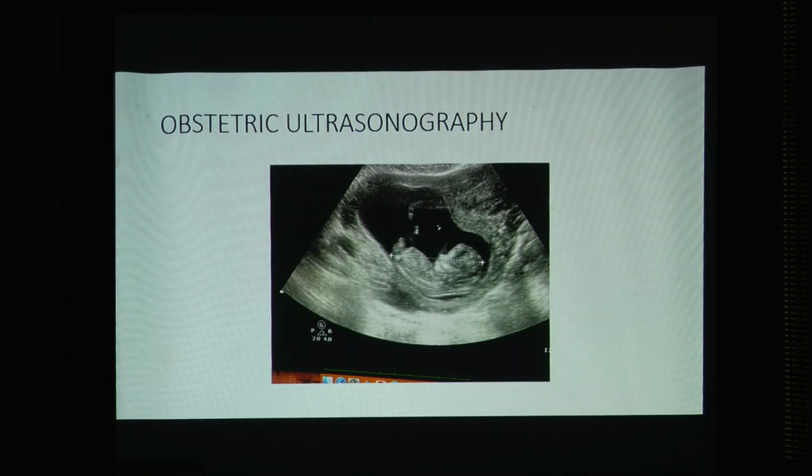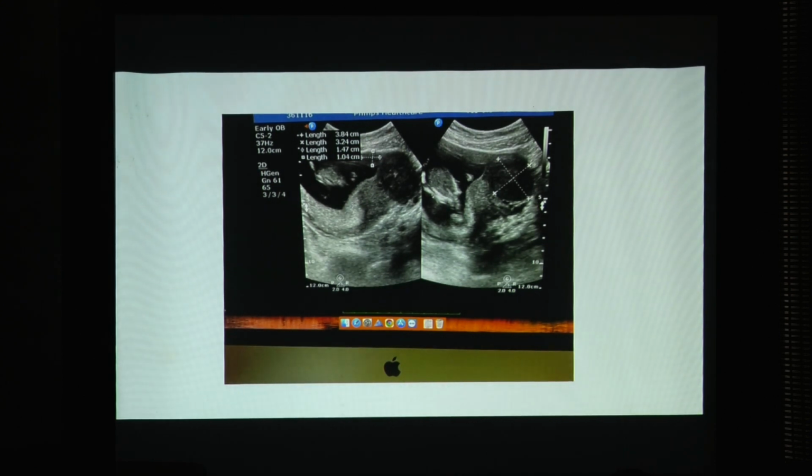Now, obstetric ultrasonography is currently very popular, and we have to be meticulous in the scan, and you have to act according to the PCPNDT Act, etc. You have to get all the permission and keep all records. Here is an image of a pregnant uterus with a fibroid in the lower uterine segment.